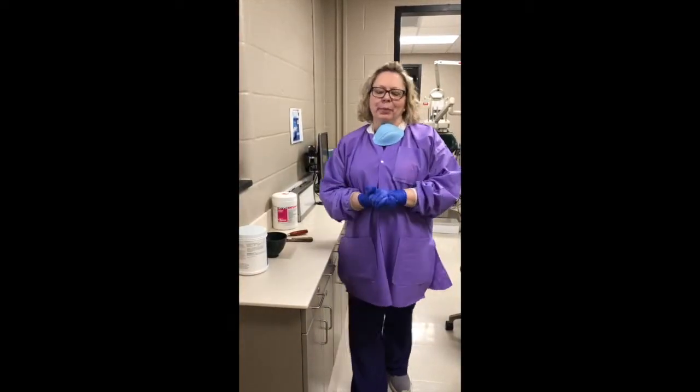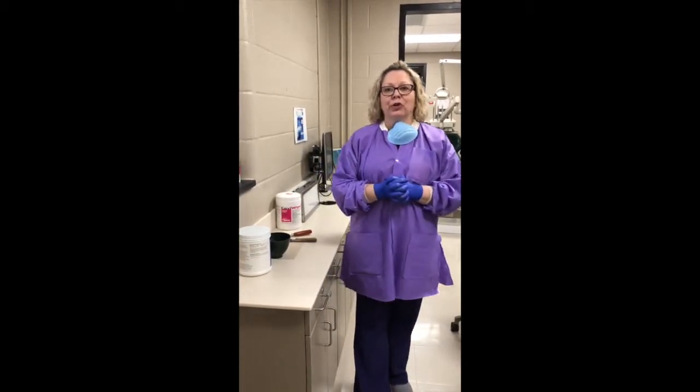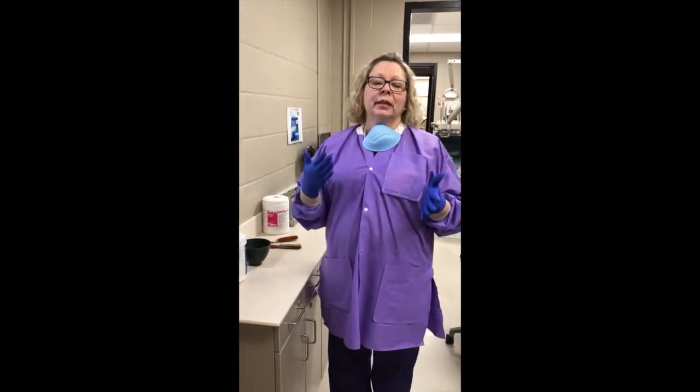Afternoon. My name is Gina Miller. I'm here with a group of students and we're going to talk about how to create a maxillary alginate impression for a patient. We use alginate impressions in dentistry for lots of different reasons.